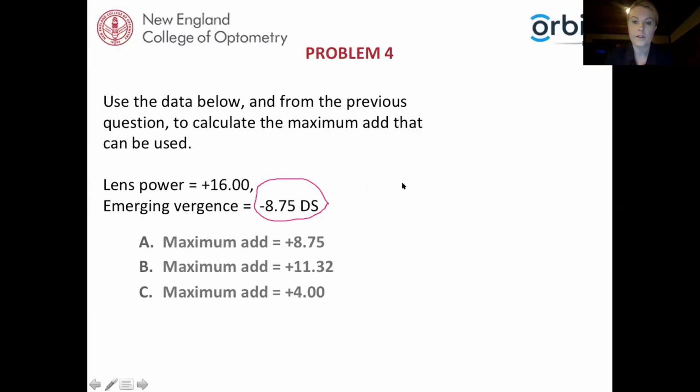So let me illustrate an example. Here we have our stand magnifier. It has a lens with some housing. We've got a piece of paper, and that represents where our object is. And then we have an image distance here.